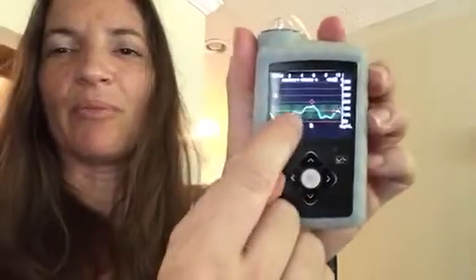And the reason I'm going to do this one is because, so here's my overnight, and I will show you that up until midnight I got minimum delivery, and then it gave me some insulin between around 1 and 3, so it was keeping me even, but that was with the minimum delivery, and those were some reduced rates anyway. There's a lot of 0.025s and everything else in there. Basically what happened is that set me up for this first climb, but that climb at 3 o'clock in the morning actually works out really well.